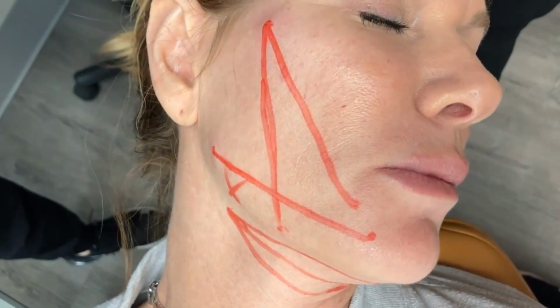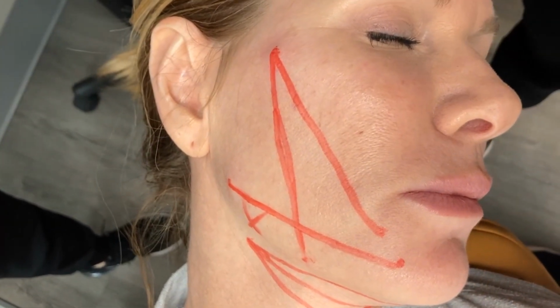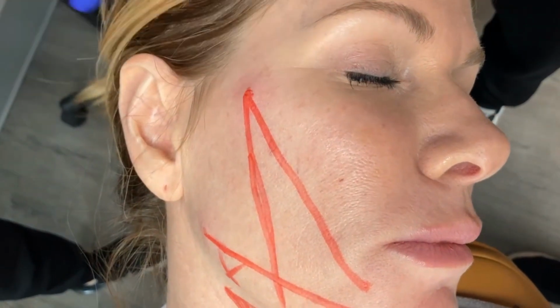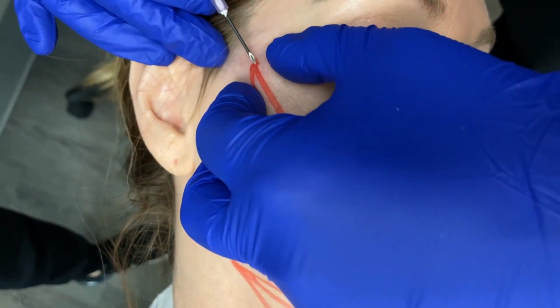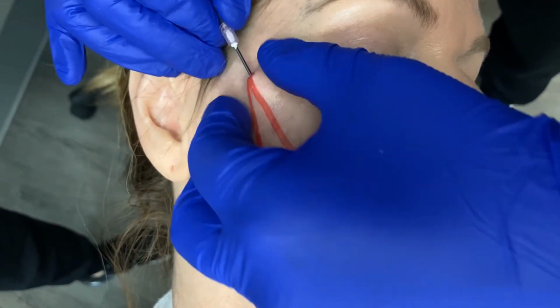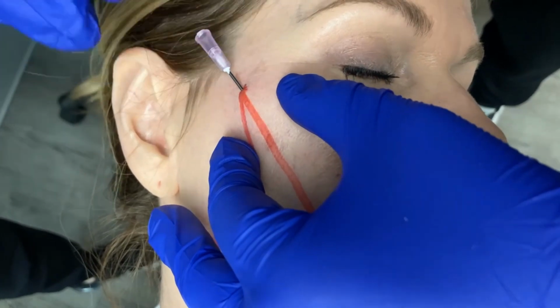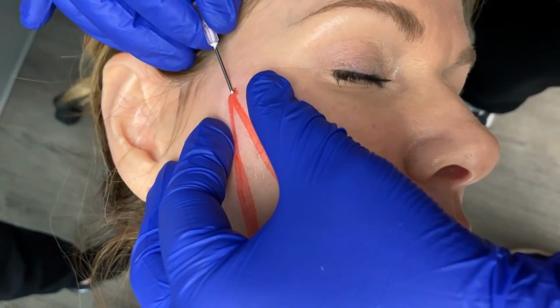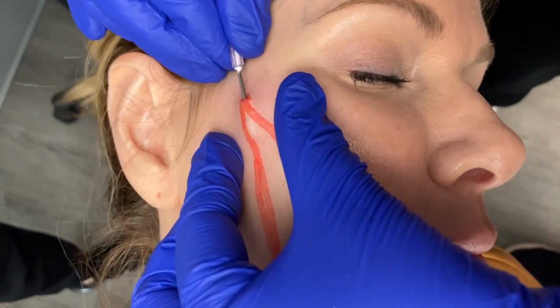And you can see 2 vectors lift up towards the cheek area and 1 vector in the jawline, pulling it back. And certainly we are going to do some neck work and a little bit of other treatment on this patient here. But here we go with an 18 gauge pilot hole needle, and we are going to go into the right plane. This is so critical right here, is knowing what plane to start in, because this will make the rest of the procedure go much easier.